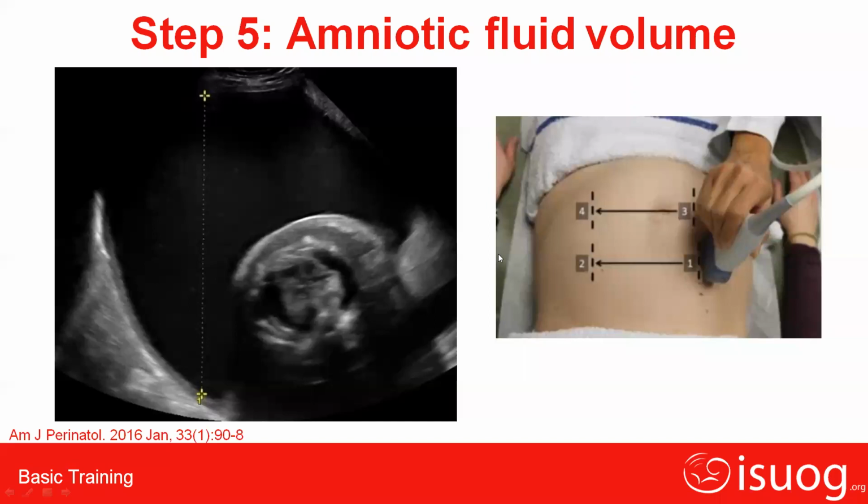Then we have to take the history, madam, whether it is due to leaking or due to renal agenesis or any anatomical cause. If there is no leaking, then we have to go for the anomaly survey. We have to find out whether the kidneys are there or not. It's the most important thing to rule out if AFI is 3 in very early pregnancy.